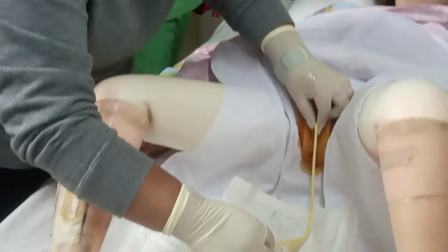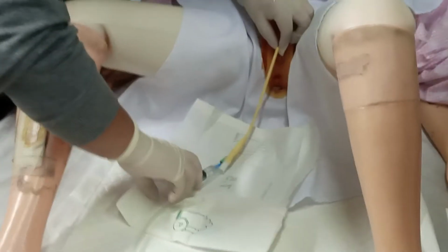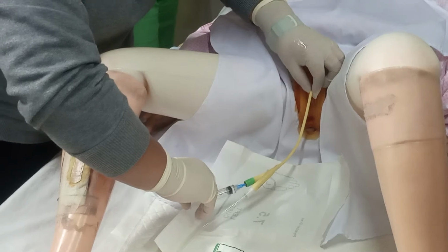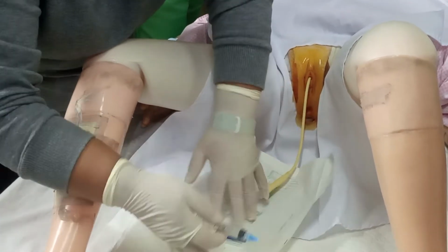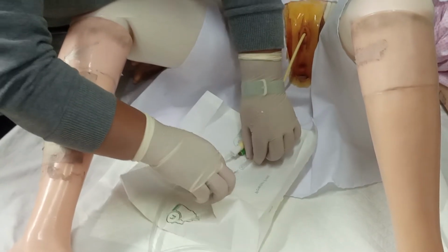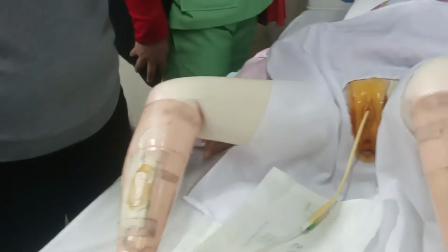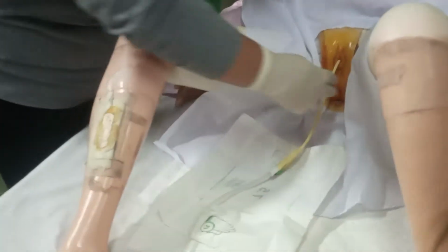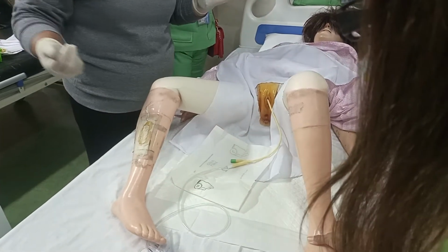May nakita ka ng ihi. Then, insert at least 2 inches more. And then, you are now going to push the water. And then you're now going to remove. Okay? So, please do the fishing. Sa side kayo mag-takip. Okay? Then, lagay mo dyan para hindi madisgrasya si patient. Now, i-try mong hugutin. Okay, positive.